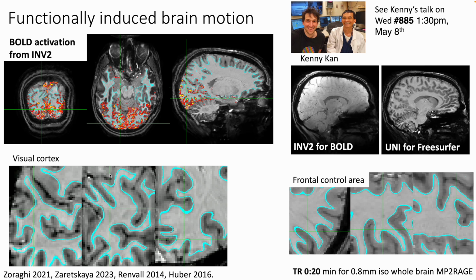And this is specific to the visual cortex. Here, for example, in frontal areas as a control, you can see how stable these lines are. And here we are not seeing these functional changes. And there's very little literature about task-based structural changes. And nobody really knows how much there are implications for the interpretation of fMRI. So most researchers just ignore it.